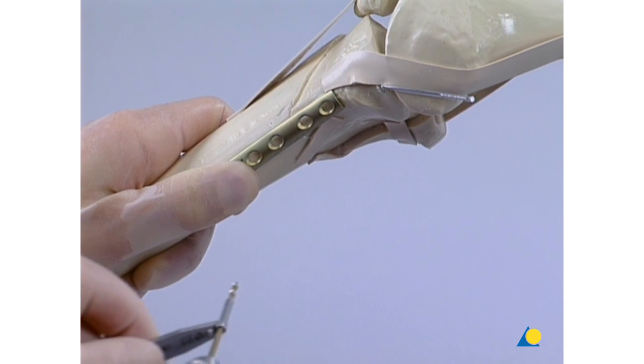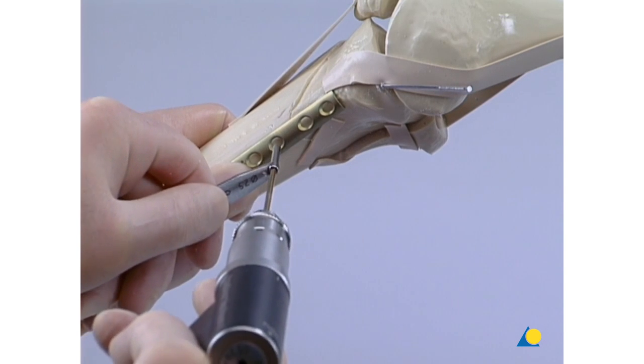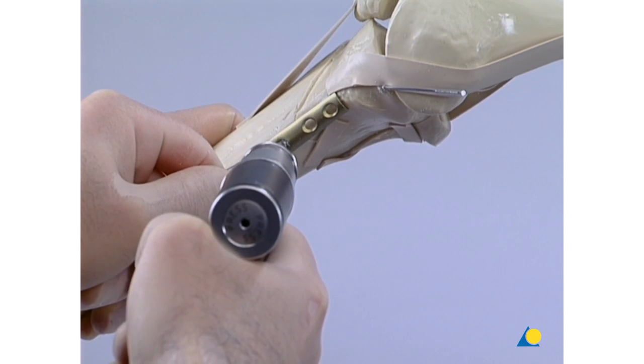Next, a 2.5-millimeter hole is drilled, just distal to the apex of the fracture, using the appropriate drill guide.